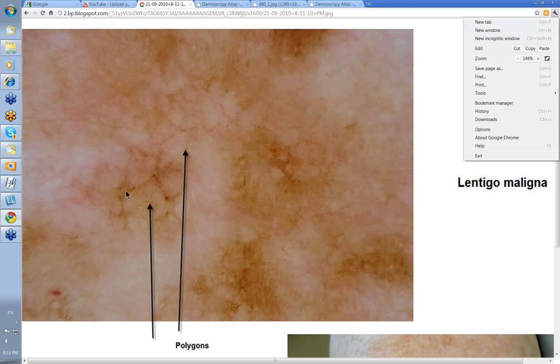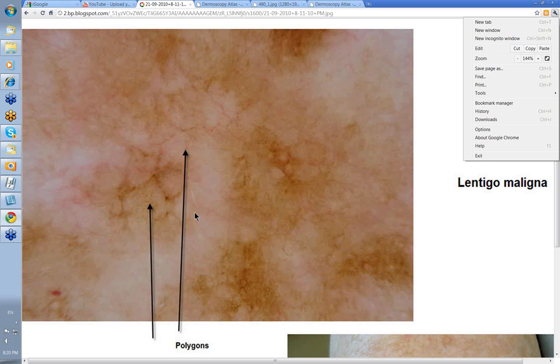These are the structures here that we're calling polygons - these multi-sided structures within lentiginous melanoma, which is in fact what this was. These can be difficult lesions to diagnose. There's not a lot of other features there that allow you to make a diagnosis of lentiginous melanoma off the face.